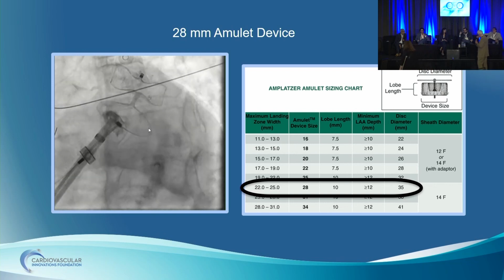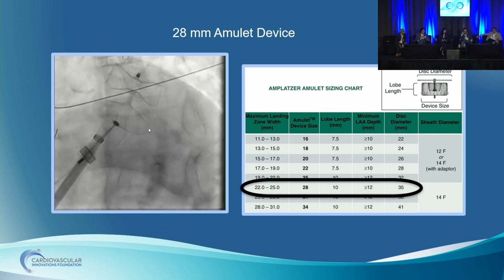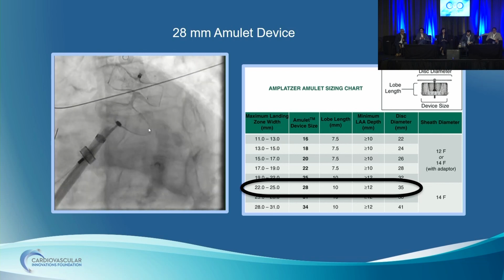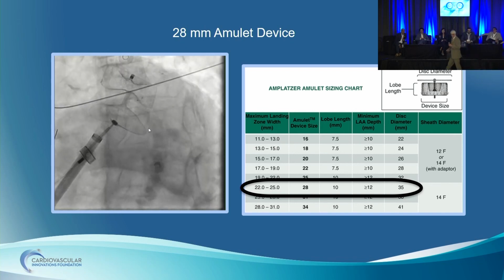Yeah, absolutely. Okay. And for this particular case, did you have a steerable catheter or was this a fixed curve? Only because it looked like on your first left atrial appendage angio, you were not quite coaxial with it. Was that one of the issues? This is the double curve. Okay, so it's not a steerable. Not a steerable. Okay, in the interest of time, Cliff, if you can keep moving. We won't interrupt you, I promise.